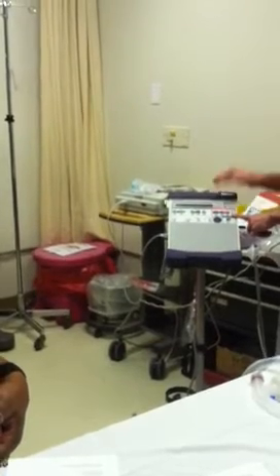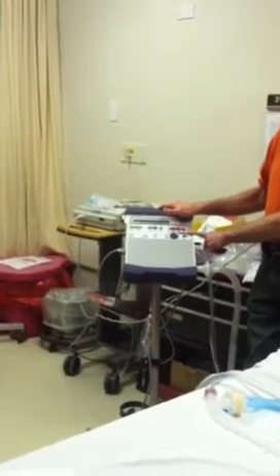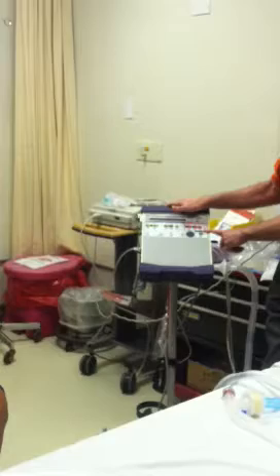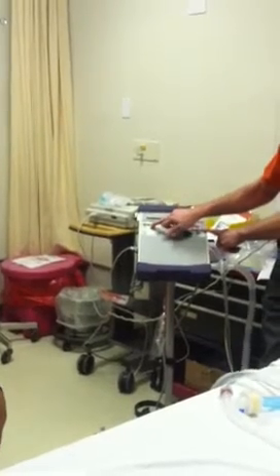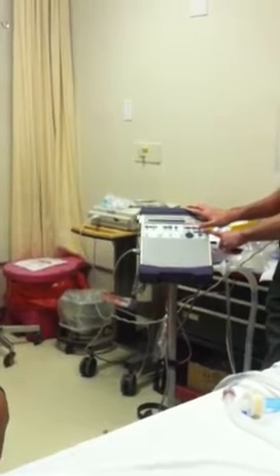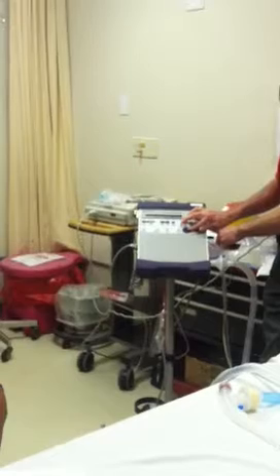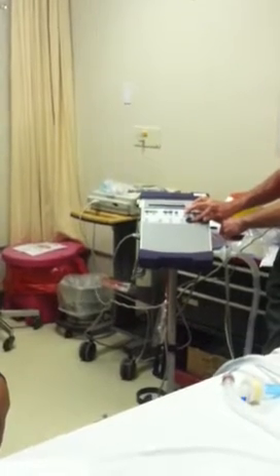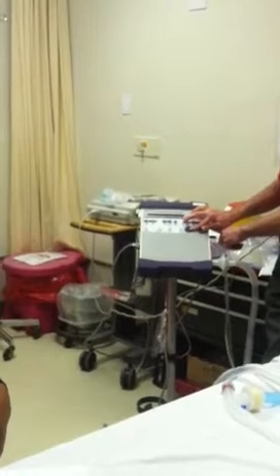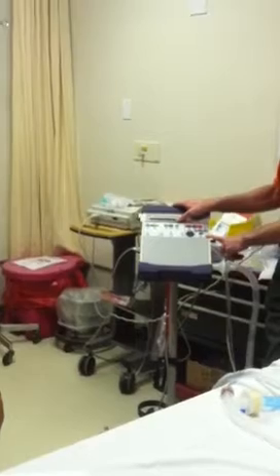So we do another blood gas, and they're saying, well, we need a little bit more oxygen. So, they're kind of a big person for such a small tidal volume. So we're going to hit the tidal volume, everything else is going to go dim. So I'm going to turn their tidal volume up to 700. And we're going to do a blood gas from 700 to see how it is. So we're switching to 700.